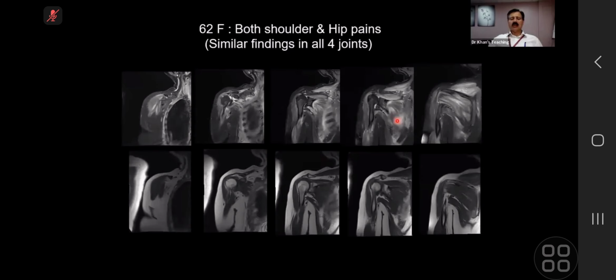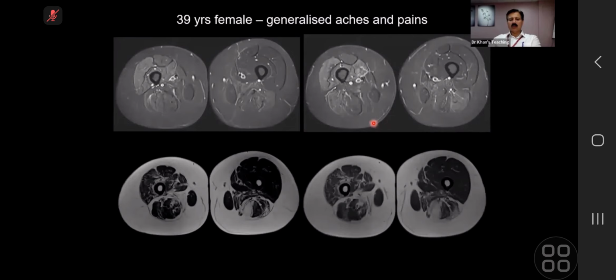At times they will like to do a biopsy from the muscle in which there is edema, just to document the diagnosis. At times they will just go with an MR and clinical findings and might not do a biopsy. So CK, etc. will be increased. So this is the myositis protocol. So remember, the myositis protocol is like the spondyloarthropathy protocol.